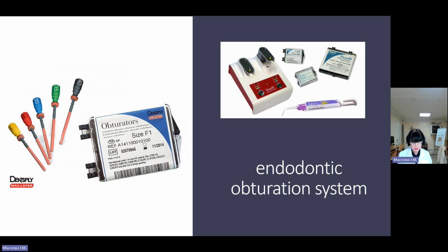Gutta-percha points impregnated with metronidazole. According to the abstract of a study conducted at a Chinese university, controlled delivery gutta-percha points containing metronidazole compounds were made and placed in prepared extracted teeth.